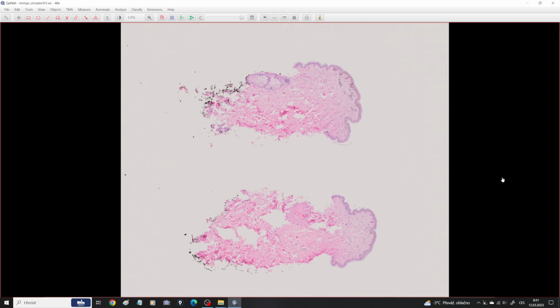it's always good to keep in mind that it can be a melanoma. And again, in opposite, if something looks worrisome under the microscope, and it is a small child or young adult, it's good to pause a little bit and step back and not to diagnose everything as a melanoma, because there can be a lot of benign nevi, and some of them are typical for young age, that can look really worrisome and that can be very easily mistaken for melanoma. So it's good to keep in mind, and as I said, the clinical setting is very important here.